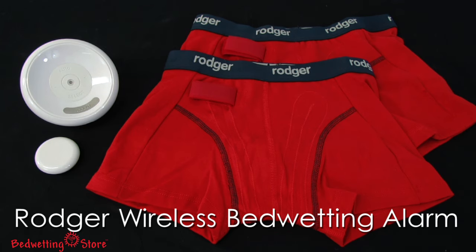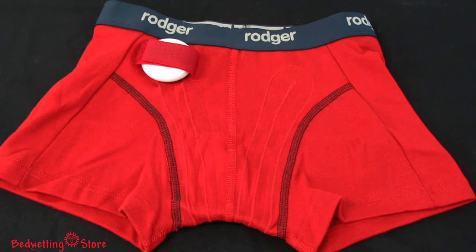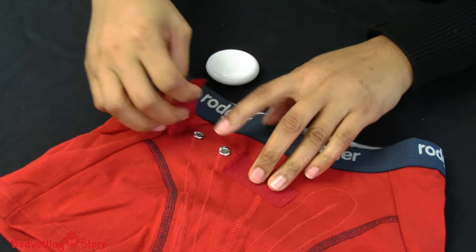The Roger Wireless bedwetting alarm system features unique moisture sensing underwear and uses wireless technology to solve your child's bedwetting problem. The comfortable unisex briefs have sewn-in moisture sensing threads which allow the entire brief to sense the urine. This enables the Roger Wireless to detect wetness faster than most other bedwetting alarms and saves you from having to worry about sensor placement.